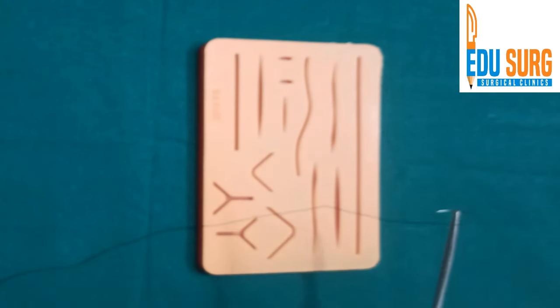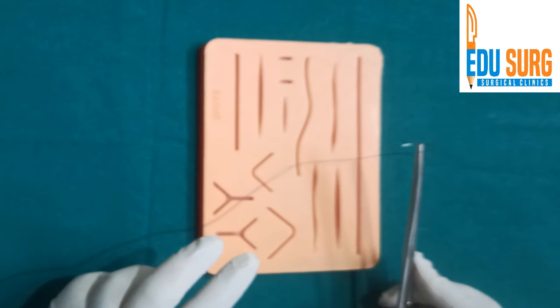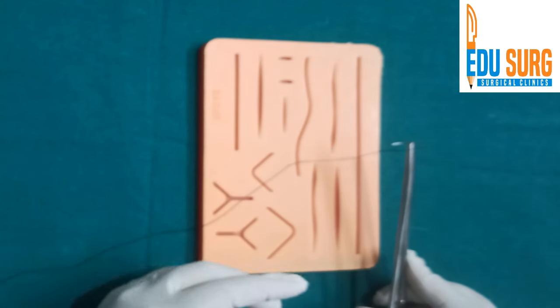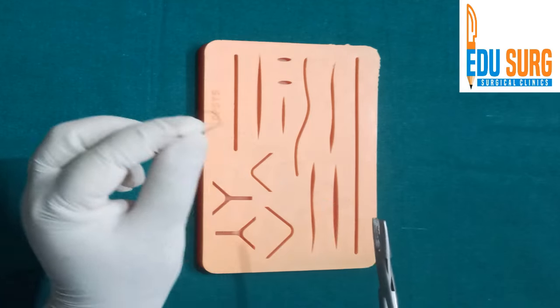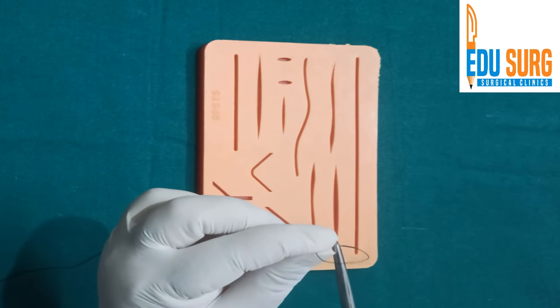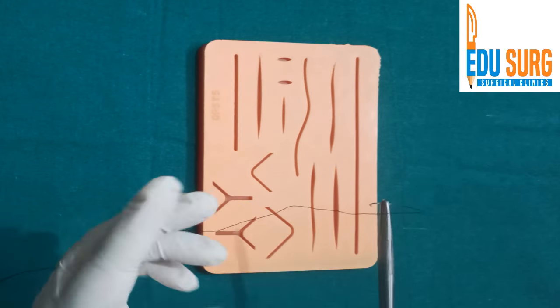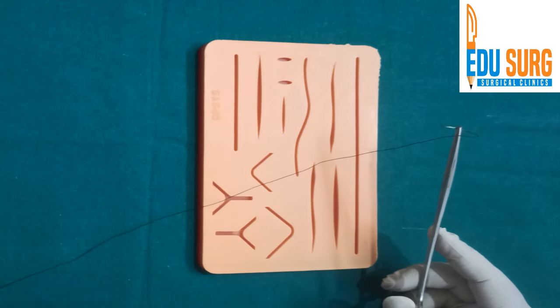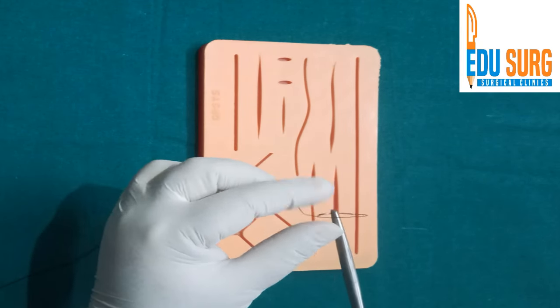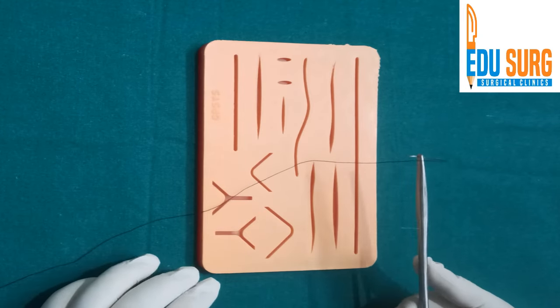Remember not to touch the needle. This is a very important point and skill station marks are many times cut if you are holding the needle like this. Why is this important? It is not just fashion. Needle injuries are very common especially in the beginning years, and if you hold your needles like this you can get injured.